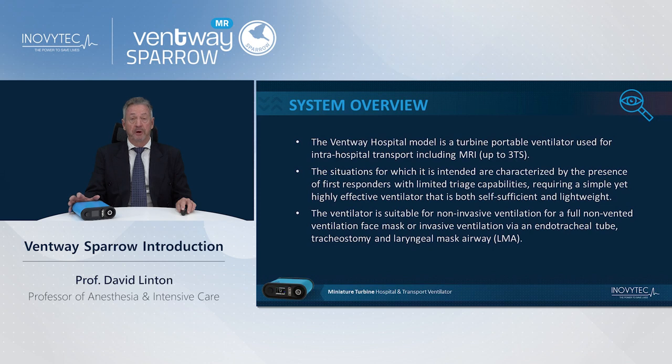It's suitable for non-invasive ventilation using a face mask, and it can be used for invasive ventilation with a laryngeal mask airway, an endotracheal tube, or a tracheostomy. You have the ability to switch between invasive and non-invasive, allowing leak and not allowing leak.